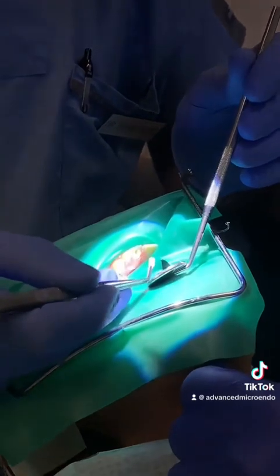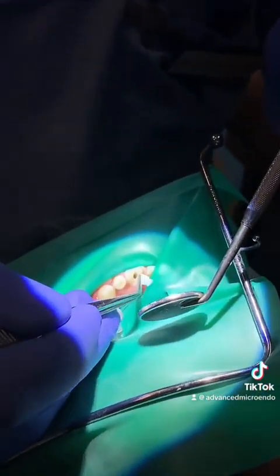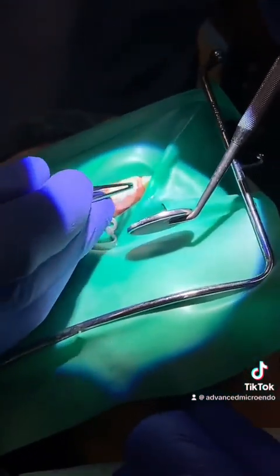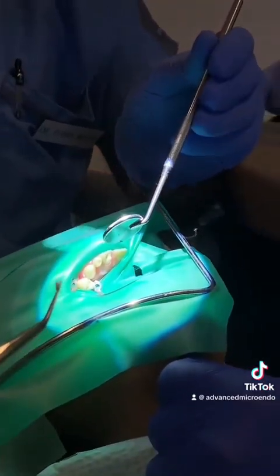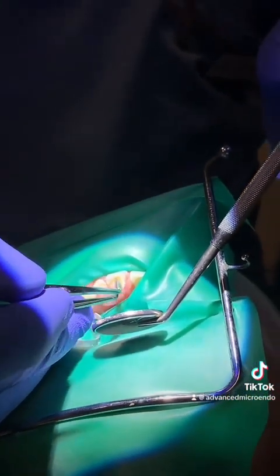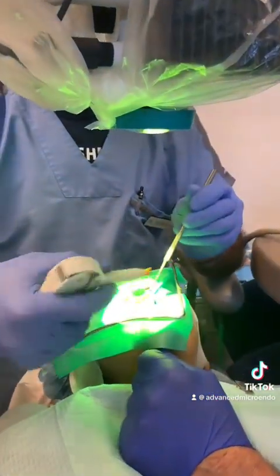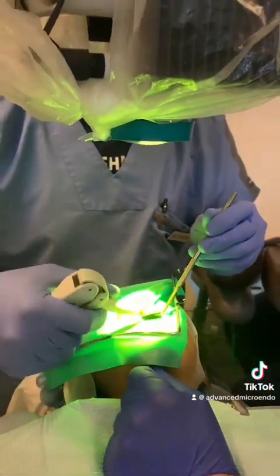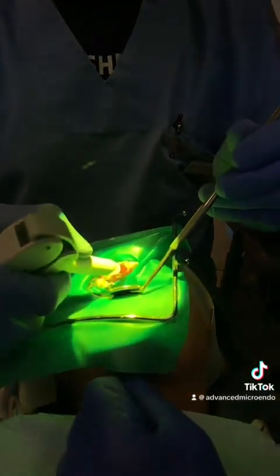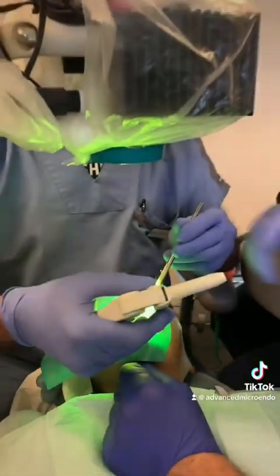ISO, just clean up the extra cement, sealer. Sterile sponge goes in. All right, very good. Almost done. That's Term, a dual cure temporary filling. Just like that.